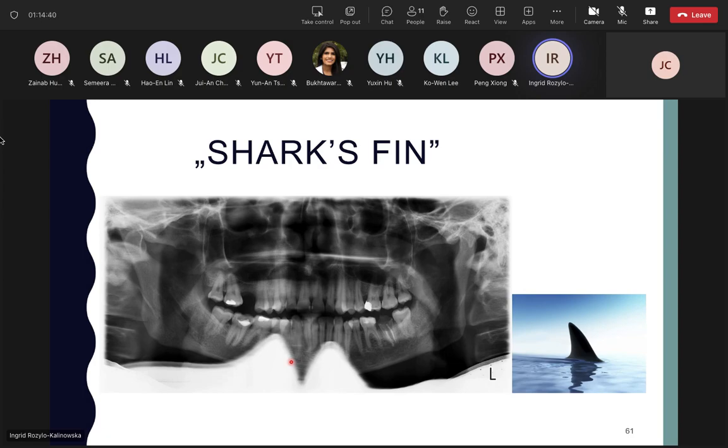If the intention was to protect himself better against radiation by putting the lead apron higher on the back, he completely did the opposite thing, because we had to retake the radiograph, and this way the patient received a double dose for this exposure.